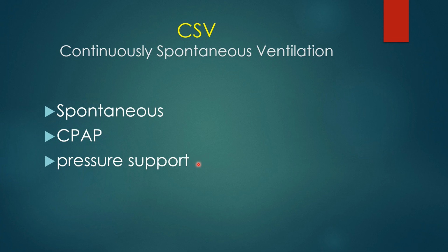So pressure support is a way to have the work of breathing shared between the patient and the ventilator. As we turn up the pressure support, we're turning up machine work of breathing. And if we're turning up machine work of breathing, then we're turning down, hopefully, patient work of breathing. So as we increase the pressure support, the patient gets bigger tidal volume, or he gets the same tidal volume, but with less work. So pressure support, we should think of that as machine work of breathing.